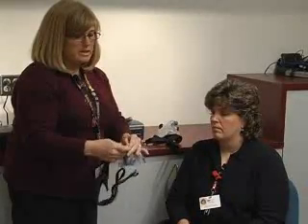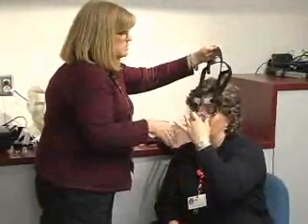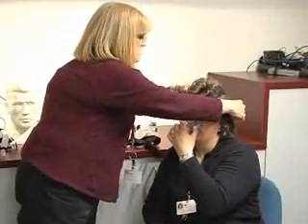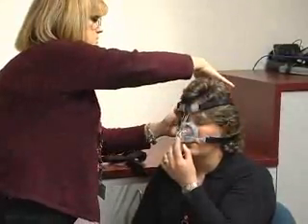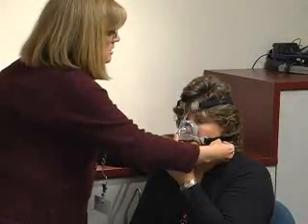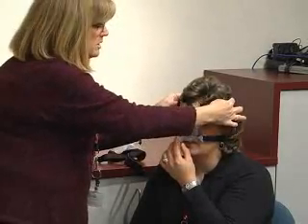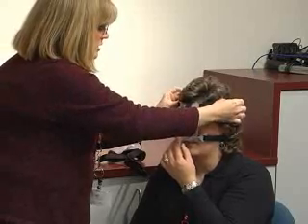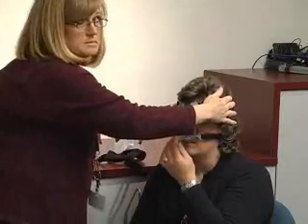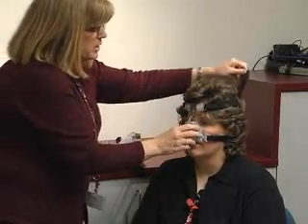This is a nasal mask that covers the nose. For this mask, it's easy in and out by taking the black strap through the hook. Undo one side of the headgear at the strap, hold the mask, take the tail, lift it up, put the patient's nose into the mask first, then pull headgear up and over. Notice with this headgear, straps are running right around the temples, to the back, to the base of the neck, coming underneath the ear, looping into the hook, and snugging up the straps with your Velcro pull tabs. You don't want to over-tighten the mask — that can cause skin breakdowns, cuts, and bruising. So gently secure it, with a minimum of one finger underneath the top and bottom headgear. Once the patient is finished using the unit, simply hold the gray hook, take the black strap through the hook, and bring headgear up and over.